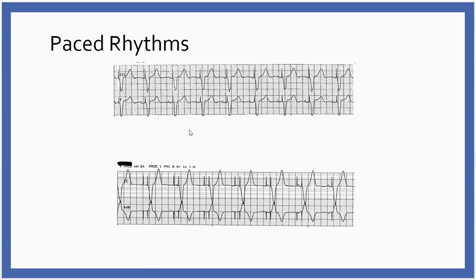So the pacemaker has a generator sensor that's typically a tiny little thing that's implanted in a subcutaneous pocket, under the skin, beneath the clavicle, and then there's a wire or wires that are dropped down into the right side of the heart. And those wires are monitoring to see what's going on with the intrinsic rhythm, and then we'll send an electrical impulse, depending on how the pacemaker is programmed, and the doc will program that.